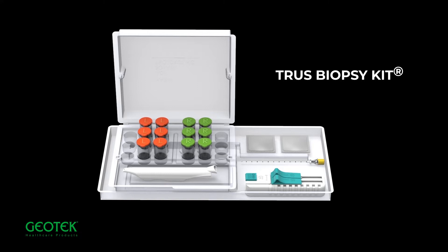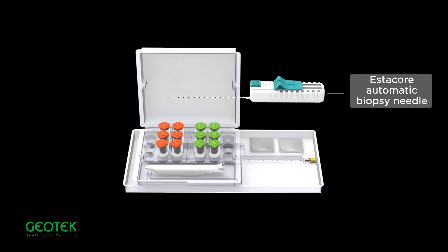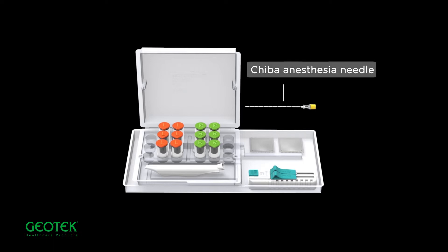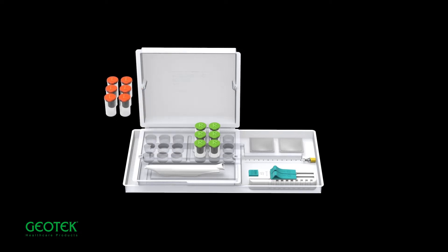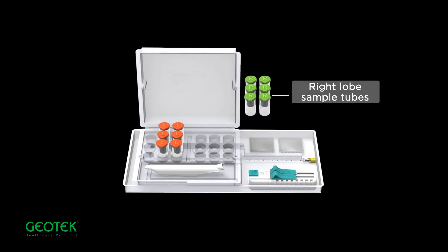Truss Biopsy Kit components: Estacore Automatic Biopsy Needle, Chiba Anesthesia Needle, Geotech Disposable Biopsy Needle Guide Attachment, Probe Cover, Left Lobe Sample Tubes, and Right Lobe Sample Tubes.